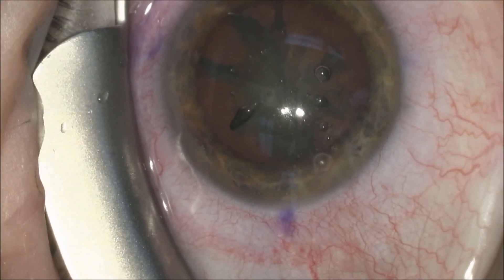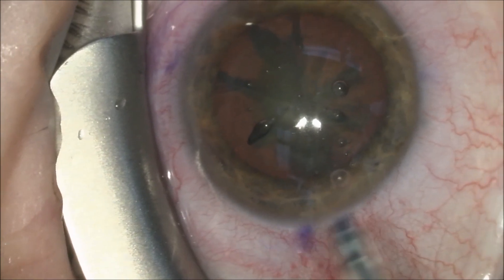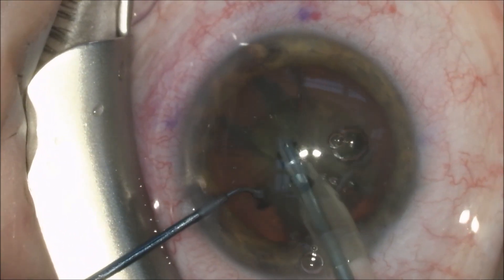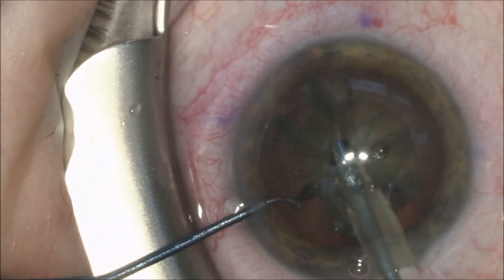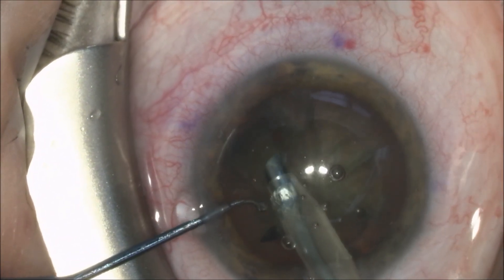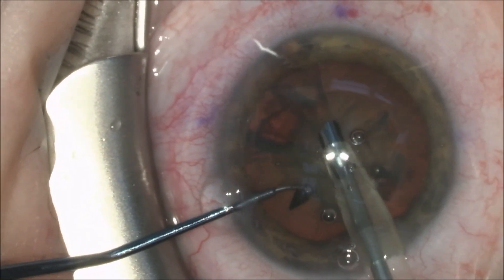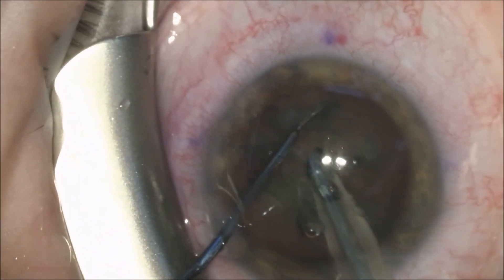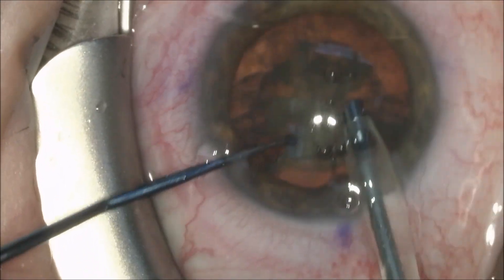We use here a Stellaris Elite Phacoemulsification Unit to remove the cataract fragments using high vacuum. We can see that the first piece of the nucleus is rather resistant to being removed with the phacoemulsification handpiece.